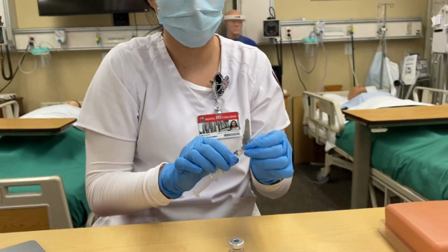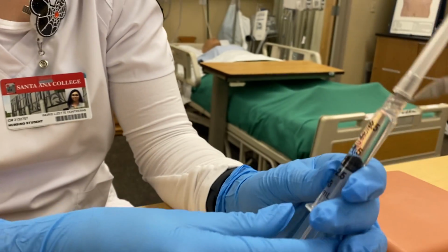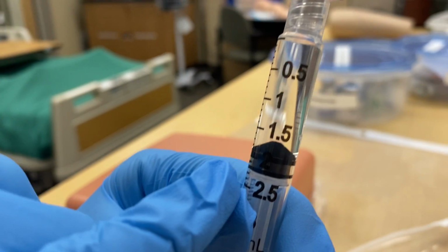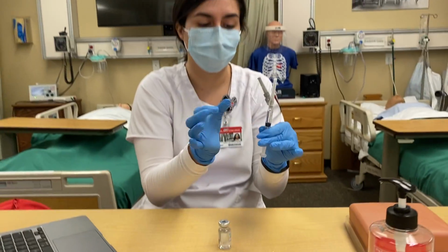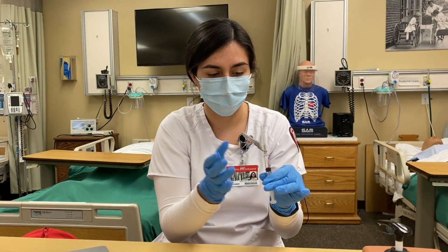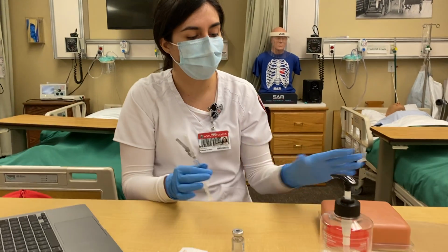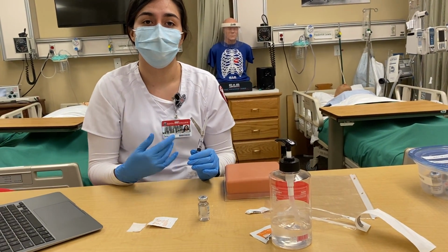Scoop. For this one, I don't have to go with another nurse to identify. It's going to be 2 mLs right there. And I have a bubble, but it's leaking. Okay. So I'm going to go to my patient. I'm going to tell them what I'm giving, just to make sure they're okay with it.